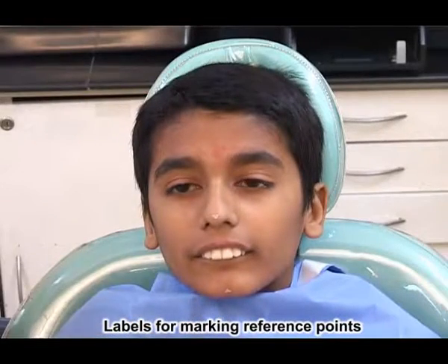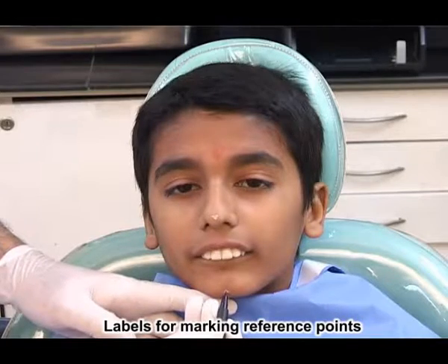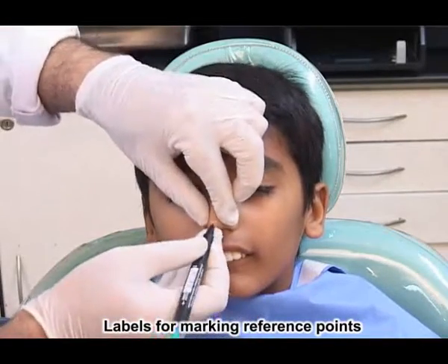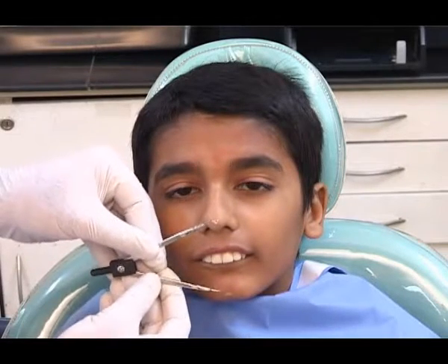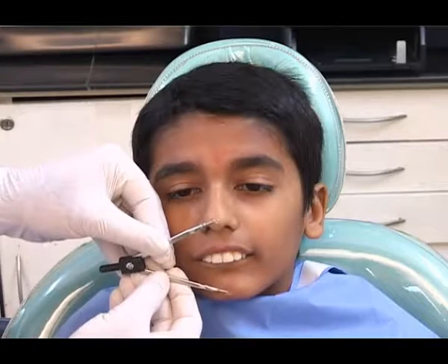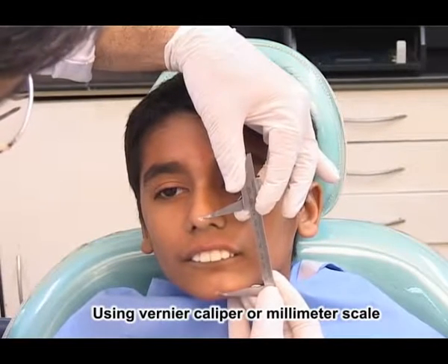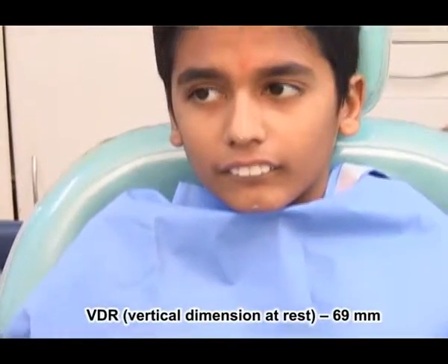It's a good idea to place two stickers — one on the chin and one on the nose. When the face height is measured, it's a good idea to ask the patient to remain relaxed. This can also be done using a caliper. The measurement in this case is 69 millimeters, and this is recorded.